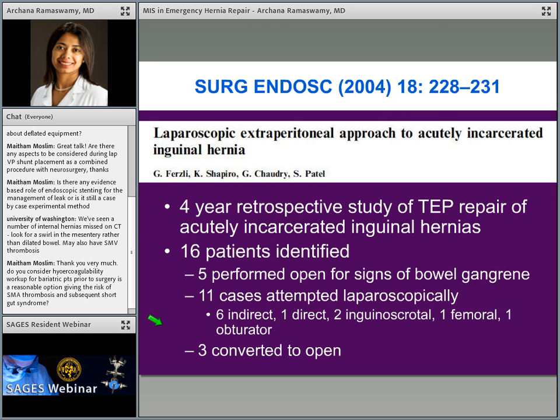Again, this is another one where you look at the skin and it looks a little bit concerning because it's a little bit dusky. But often when you go in and actually look at what's there, it's just the stretch that's made the skin look dusky. If those contents are viable, you can go ahead and do laparoscopic hernia repair. In this not-so-great patient, who's morbidly obese with diabetes, over time it's amazing how the skin that you left behind just starts to shrink and can give a pretty reasonable cosmetic outcome.